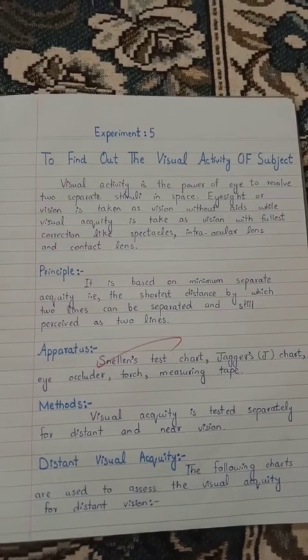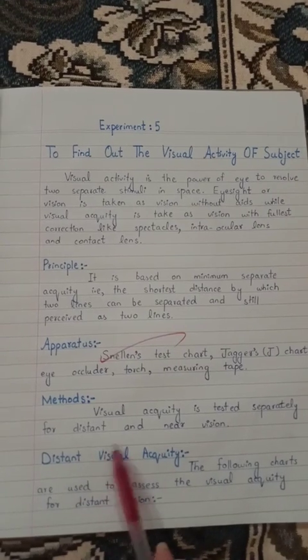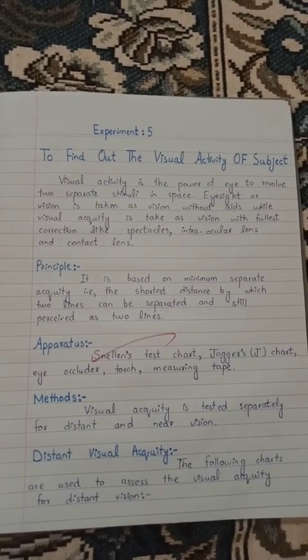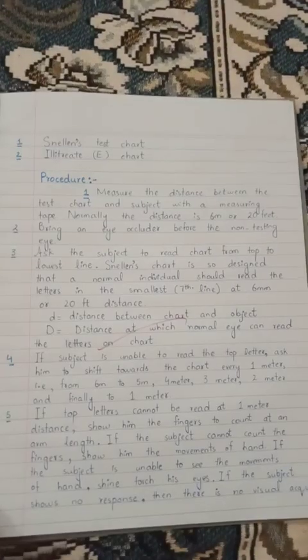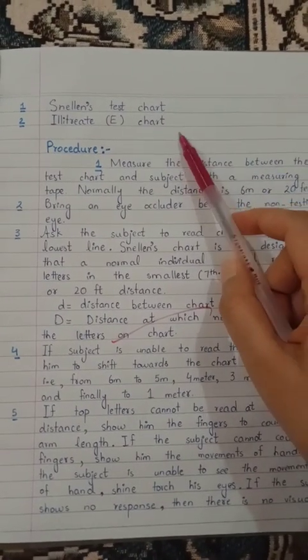Now we will discuss the methods. Visual acuity is tested separately for distant and near vision. Distant visual acuity: the following charts are used to assess the visual acuity for distant vision. Number 1 is Snellen chart and number 2 is illiterate E chart.